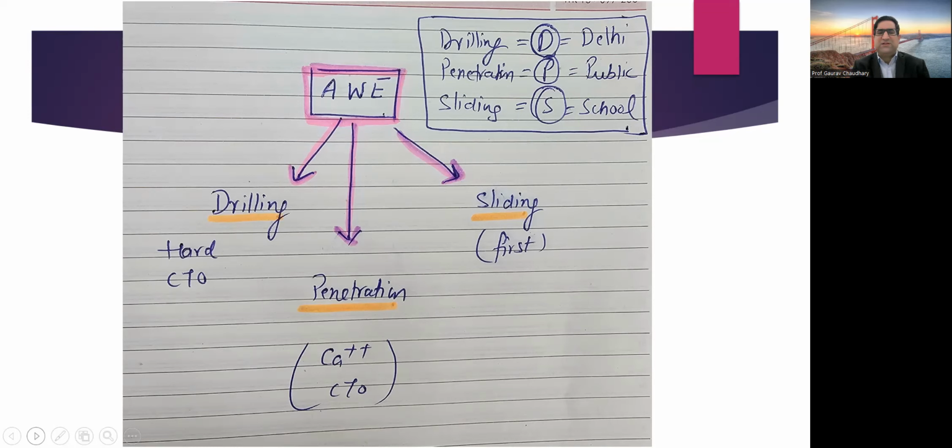Sliding means we expect a few micro channels that are 100 to 200 micrometers in diameter, and we can think that a soft hydrophilic wire with a tapered tip can slide through them. The first important thing we always have to do is to take a soft, hydrophilic wire, maybe with a tapered tip, which is more favorable, and we should try sliding across the CTO segment.